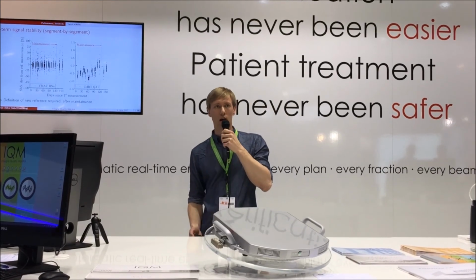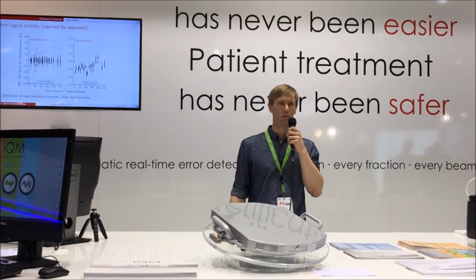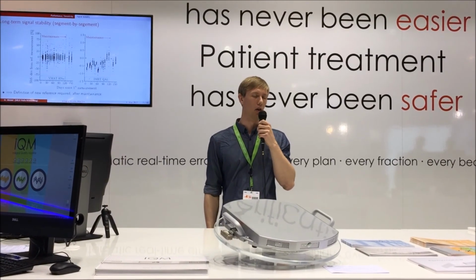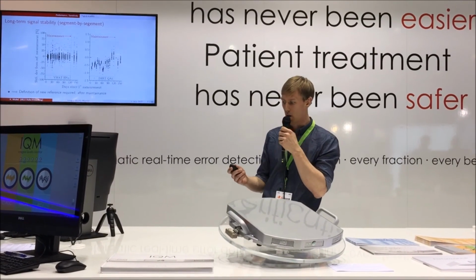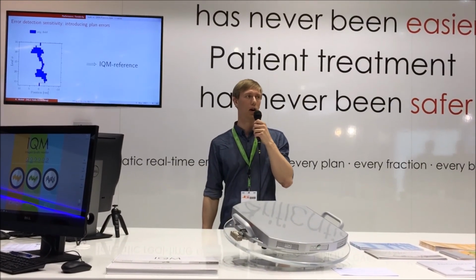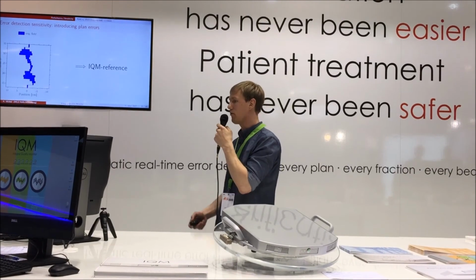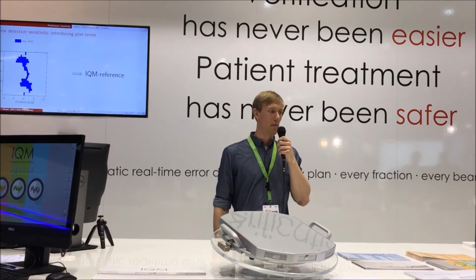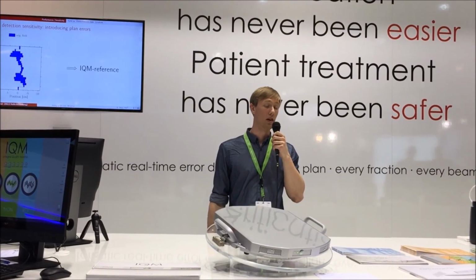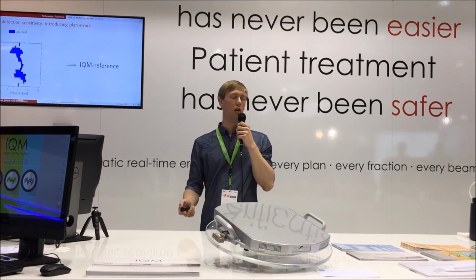So now we know that the IQM solidly can reproduce its cumulative signals with an accuracy of about plus minus 1%. And in order to learn a little bit more about the requirements for the dose verification with the IQM, we did the following. We irradiated a bunch of VMAT plans that were clinically applied at our site and set the IQM measurements as a reference. And after that we introduced some errors that were dosimetric as well as of a geometric nature, to all of those plans over the course of all segments.